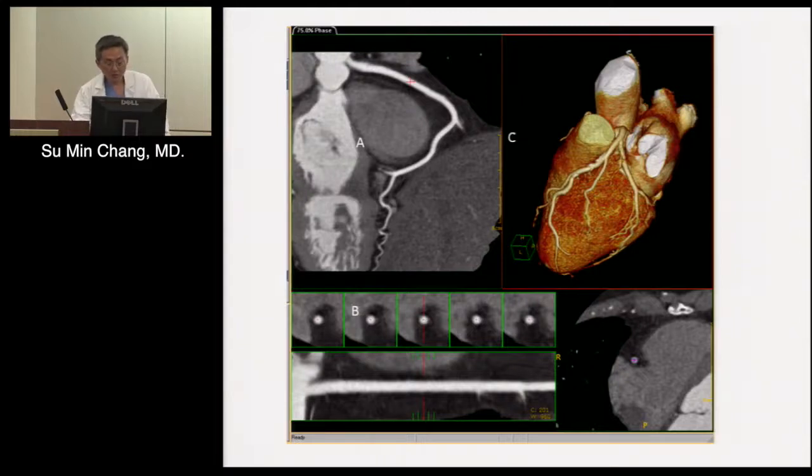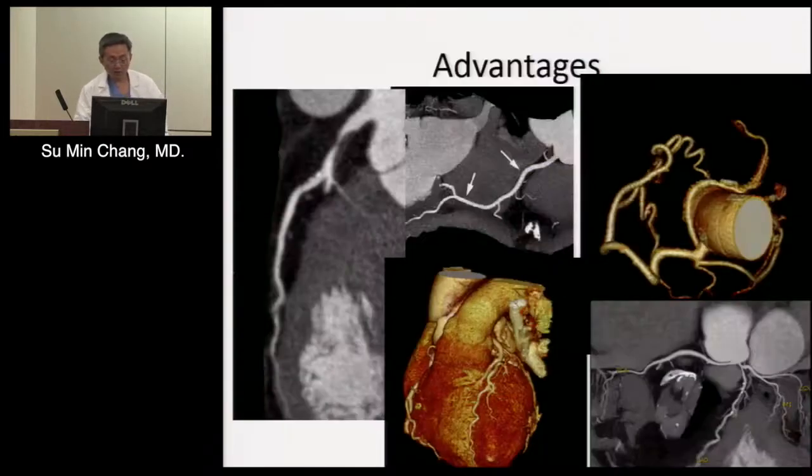So we were able to do this study. He had some atypical symptoms, and we did this coronary CTA with, I believe, less than 2 millisieverts of radiation, which is less than what you receive from the environment living here in Houston. So it's a very powerful tool. You can see perfectly clean coronaries. That's one other advantage of CT compared to invasive angiogram: you can see beyond the lumen. Besides excluding obstructive disease, you can confidently tell the patient whether or not you have atherosclerosis in your coronaries, which is very important prognostically.